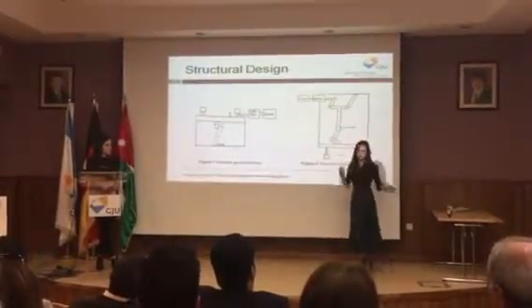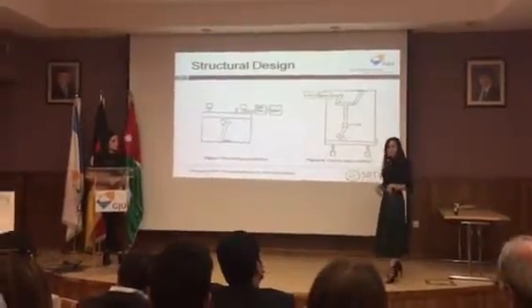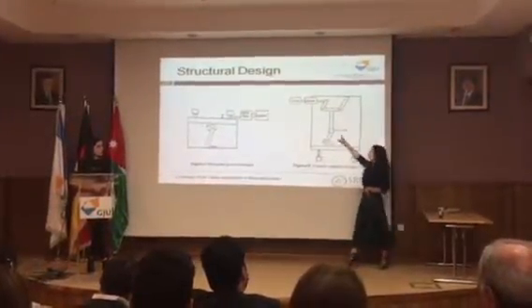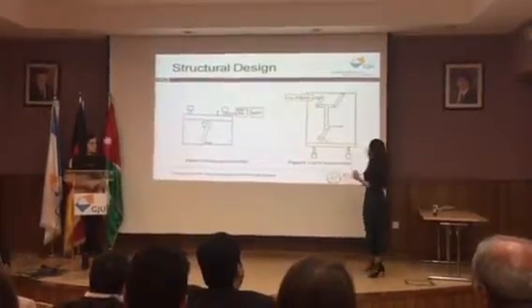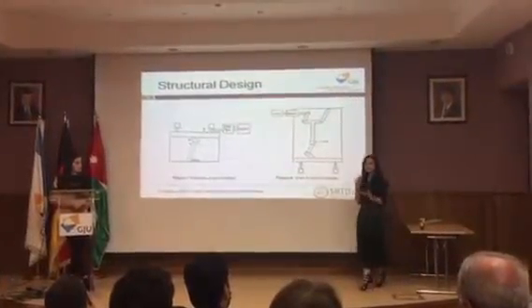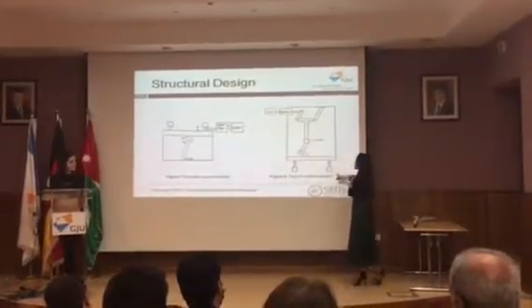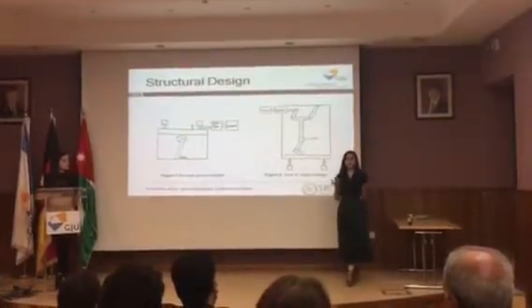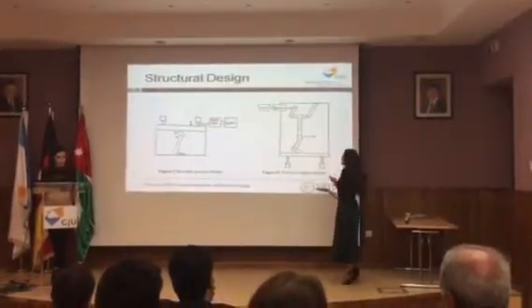We have a 4-bar mechanism. I'll explain what a 4-bar mechanism is in the next slide, but for now the 4-bar mechanism represents the hip. So we have an additional hip. We have the knee, which is driven by another motor. So we have two motors, which costs energy, but in return this system is more flexible, and we're able to study more kinetic and kinematic aspects of the prosthesis itself. Also, we have a spring on the bottom of the platform, and what the spring does is basically perform a loading and a release on the foot.